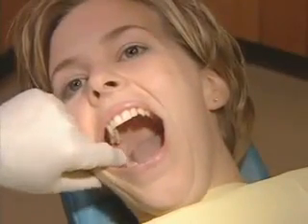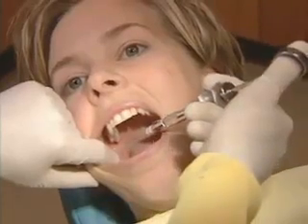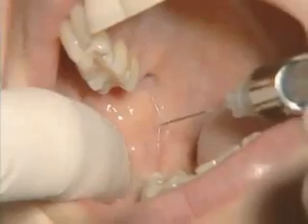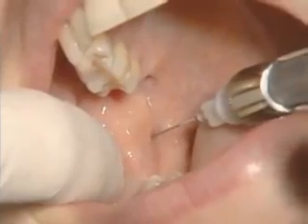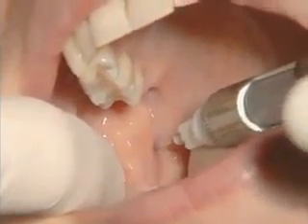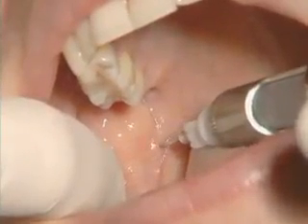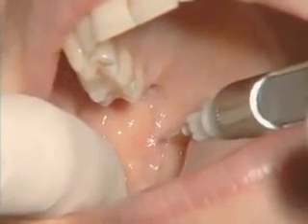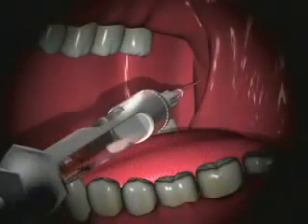After palpating the landmarks, you will be inserting the needle into the pterygo-temporal depression. The needle is brought in from the contralateral side, insertion point is directly there, and advanced slowly until you go 25 millimeters. Once bone is hit, you withdraw slightly, aspirate, and slowly begin to inject a full cartridge of local anesthetic, unless you are following with a buccal nerve block, in which case you should inject three quarters of the cartridge.